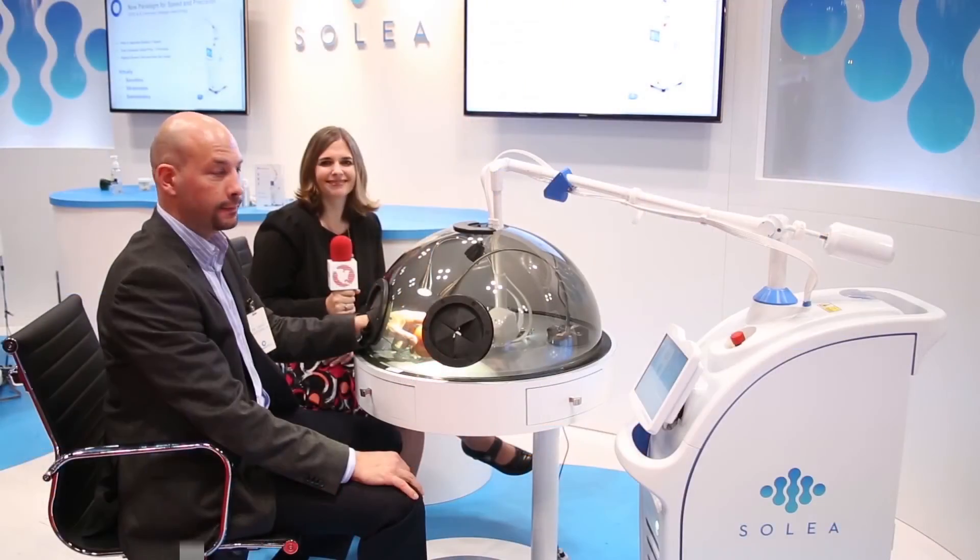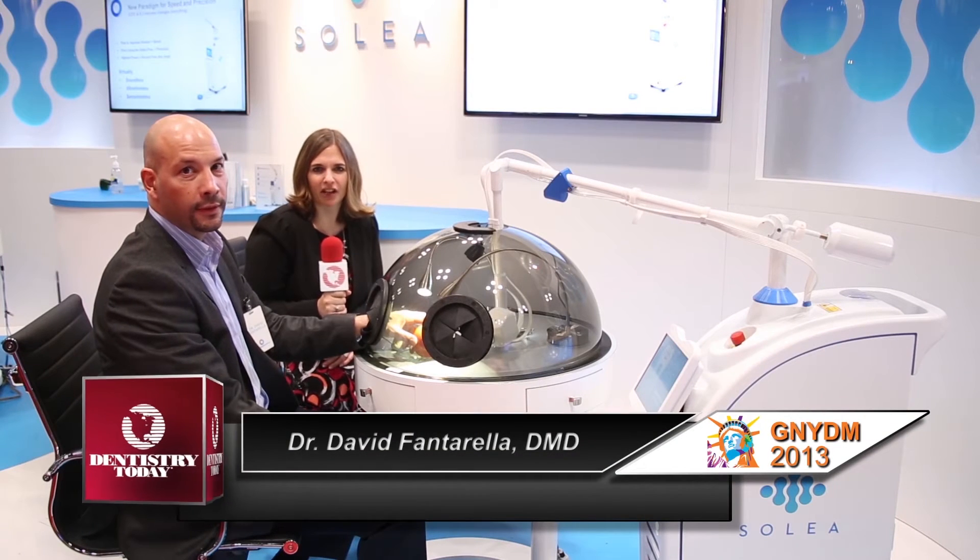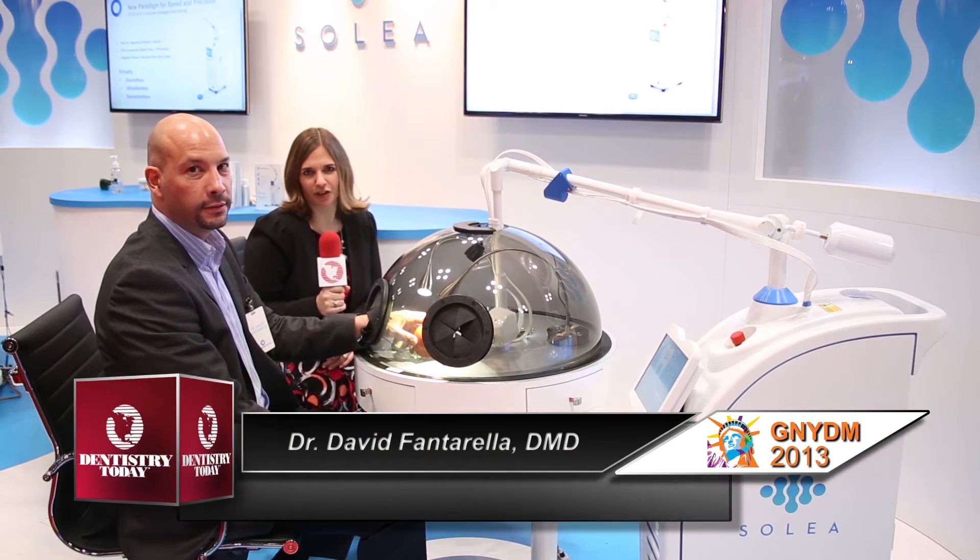Absolutely. Well, I understand you have a demonstration — shall we go do that now? We shall. Here's the demonstration. Enjoy. I'm here now with Dr. David Fantarella, who is going to walk us through a demonstration of Solea.